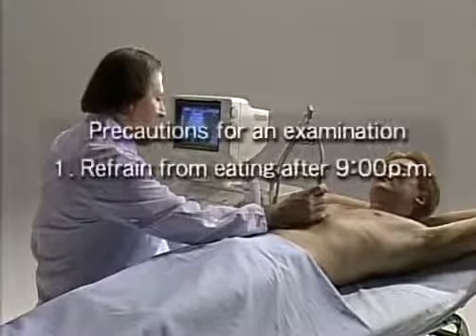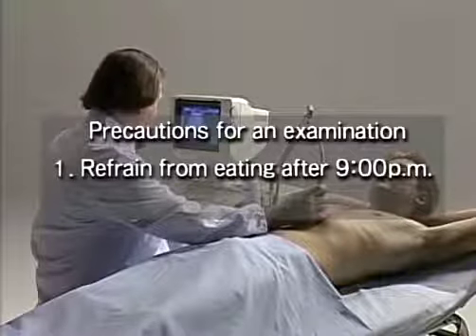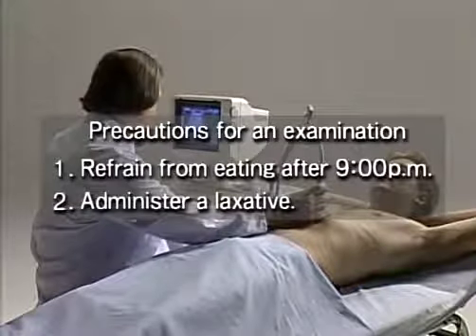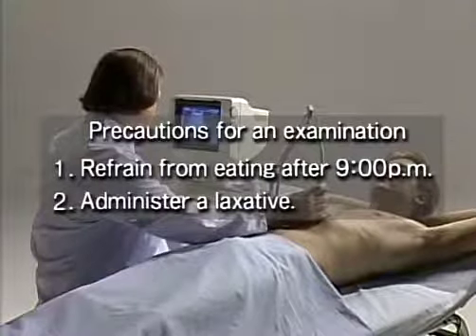To avoid this, tell the patient not to eat after 9 p.m. on the day before the examination. The examination should be performed in the morning. If the patient is severely constipated, we may administer a laxative on the previous day.